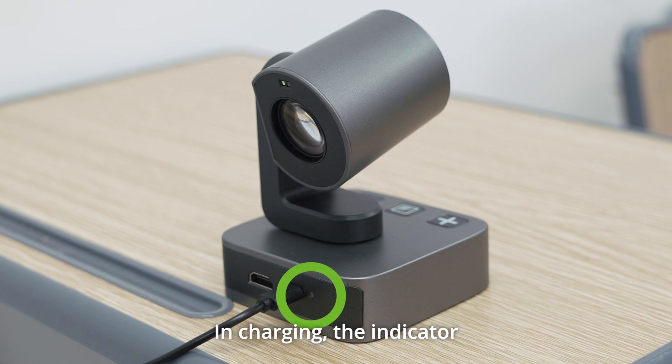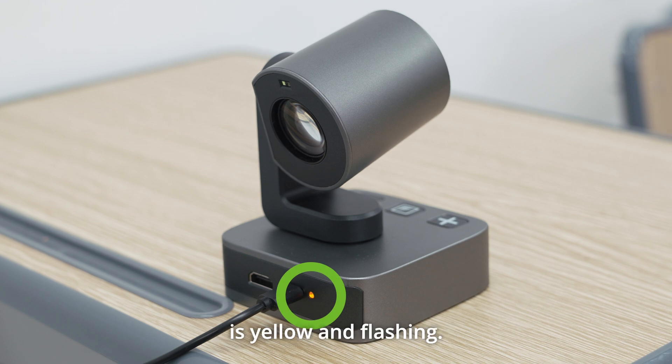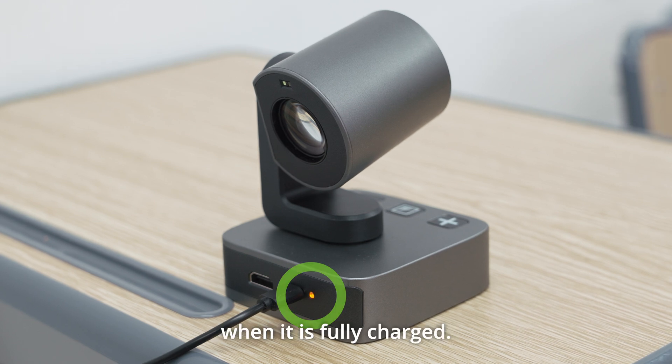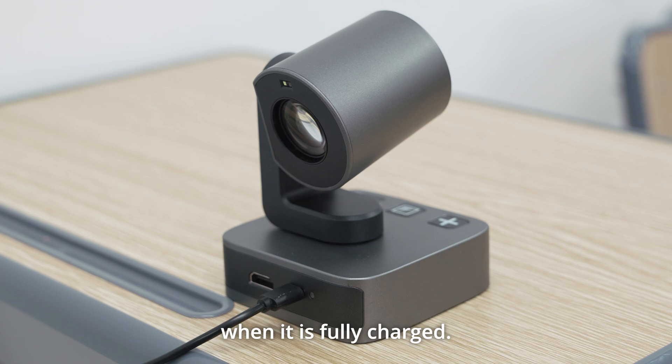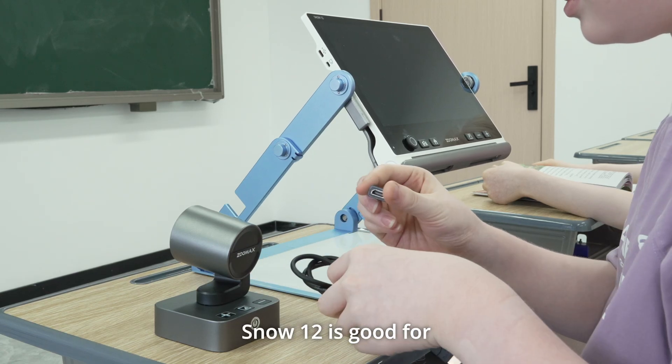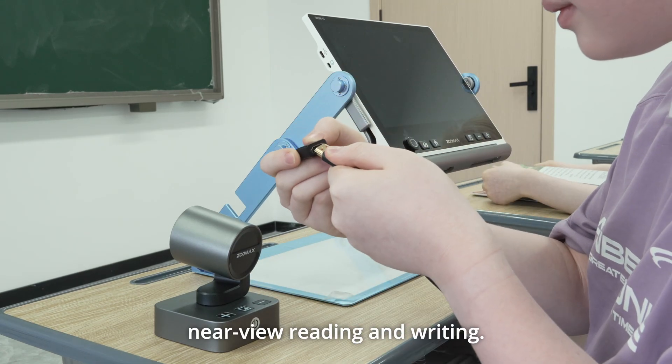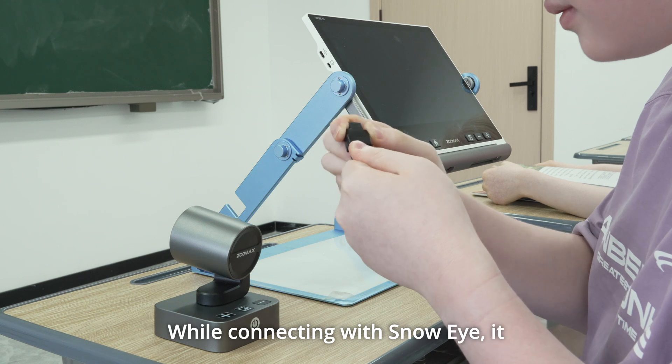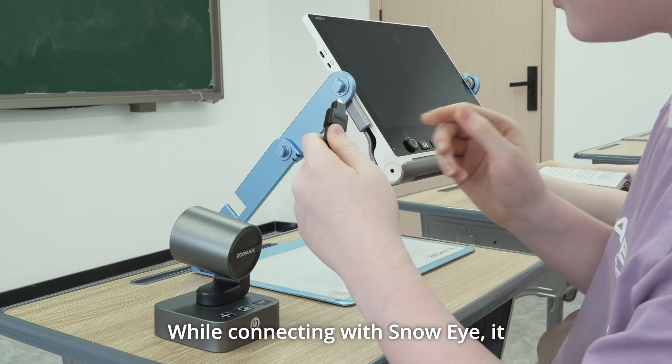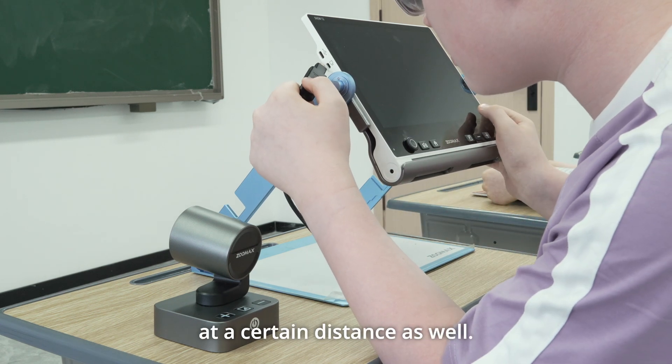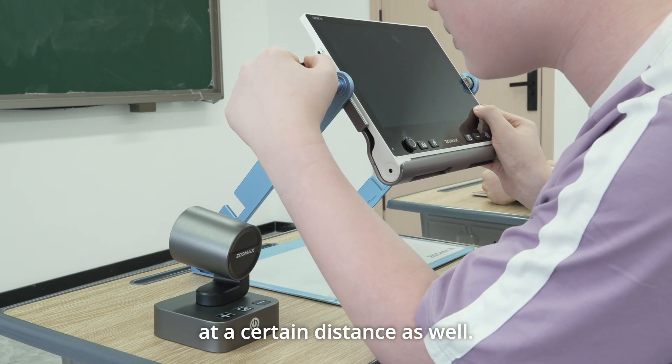In charging, the indicator is yellow and flashing. It turns off automatically when it is fully charged. Snow 12 is good for near-view reading and writing. While connecting with Snow Eye, it enables users to see things at a certain distance as well.